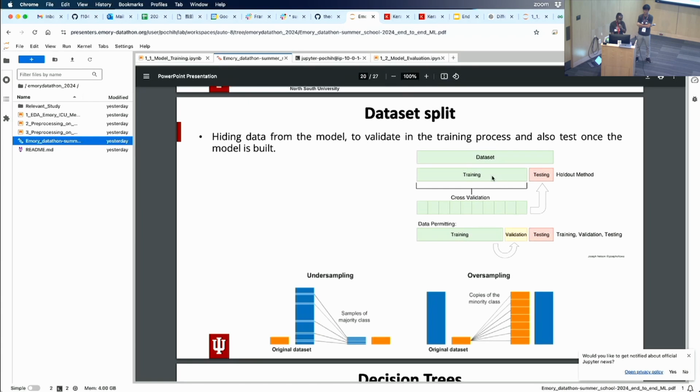So we've said that your model is not going to learn your pathology once, right? It's going to require multiple views of your whole data set, your 100,000 images, and those are called epochs. Going up the mountain every time is called an epoch. But you're limited by the GPUs that you have, and imaging requires big memory.